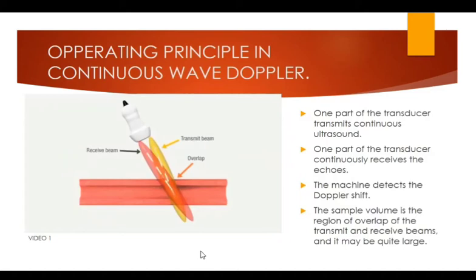Different types of Doppler also exist for use in cardiac and vascular ultrasound. Cardiac ultrasound primarily uses continuous wave Doppler. A continuous wave transducer is designed to have one part of the transducer constantly producing a sound beam and the other part constantly receiving the sound waves that are reflected back. Continuous wave transducers can also accurately determine the speed at which blood flows.